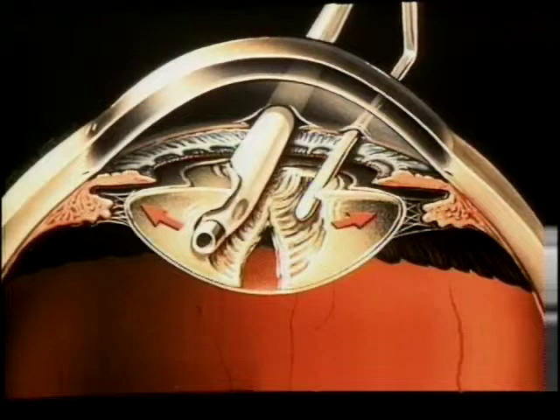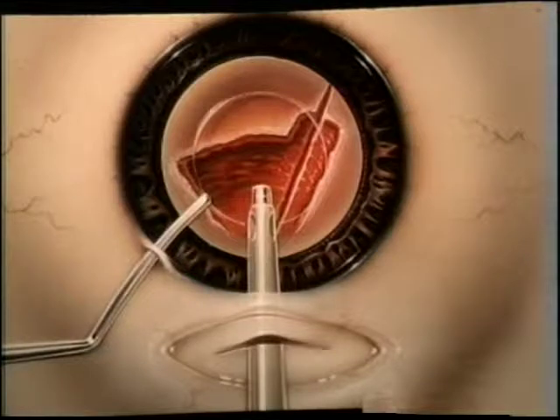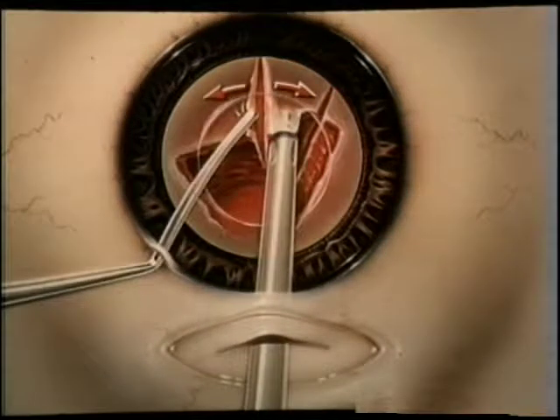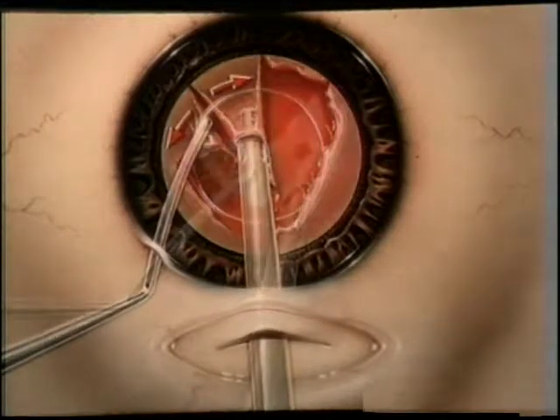Once the second instruments are deep in the center of the lens, fracturing is accomplished — pushing to the right with the phaco tip and stabilizing to the left with the spatula. The lens will usually split from the center to the periphery. After sculpting more of the upper portion of the nucleus, the surgeon then burrows deeply and creates a second crack that intersects with the first, isolating a pie-shaped section of the nucleus. The isolated pie-shaped section can then be either emulsified or left in place as a third crack is made in a similar fashion.